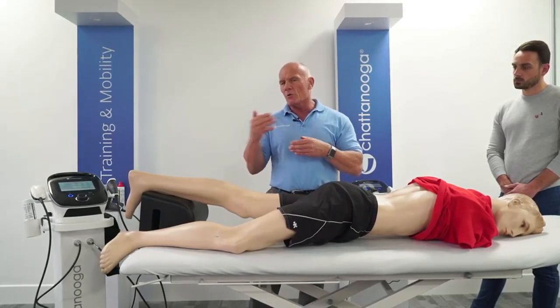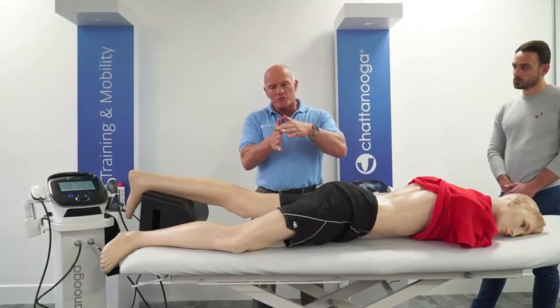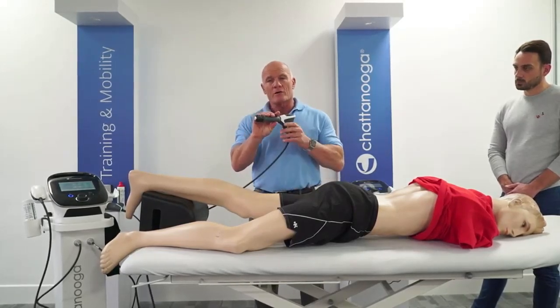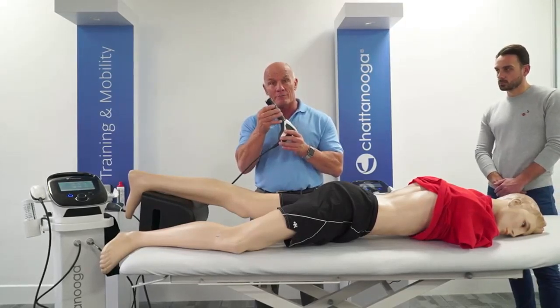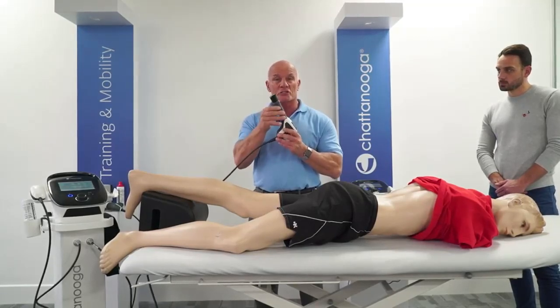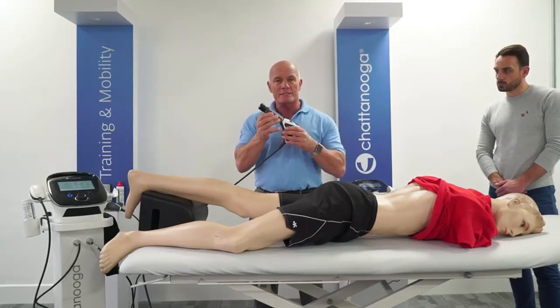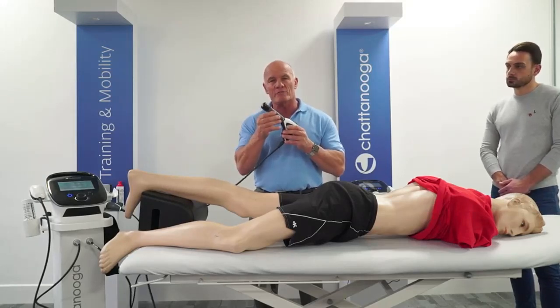But not only does it travel into the tissue, it can also travel back into the handpiece which you're holding. So it's very important that the handpiece is made of the right material, a mixture of titanium and steel rather than just steel on its own, and also has protection in order that it complies with a European directive for the prevention of white finger.